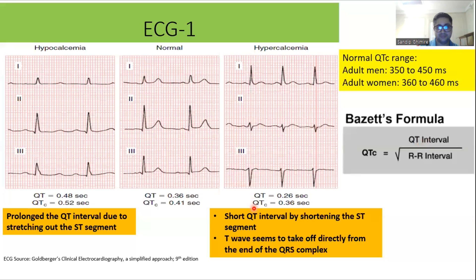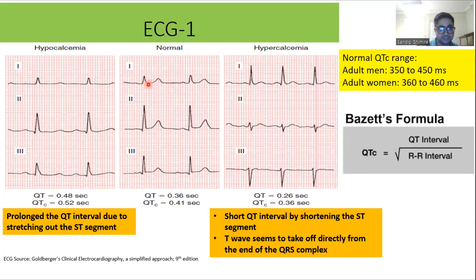As you can see in this hypercalcemia ECG, the corrected QT interval is 0.36 — shortened compared to normal. If you look closely, the T-wave seems to take off directly from the end of the QRS complex, whereas in a normal ECG there is a flat ST segment just after the QRS complex. In hypercalcemia, the T-waves start immediately after the QRS complex — this is a typical finding.